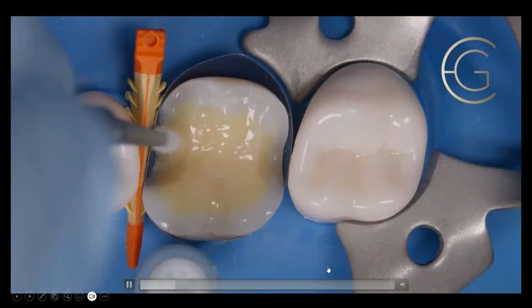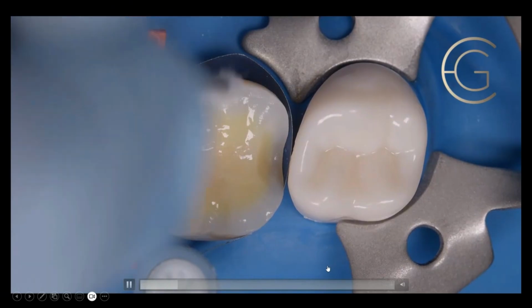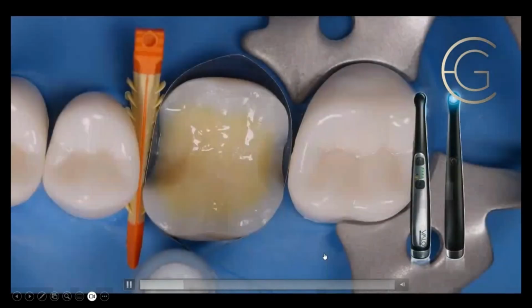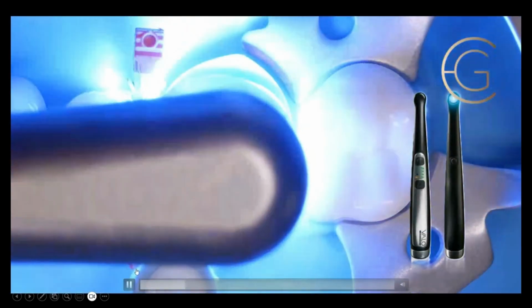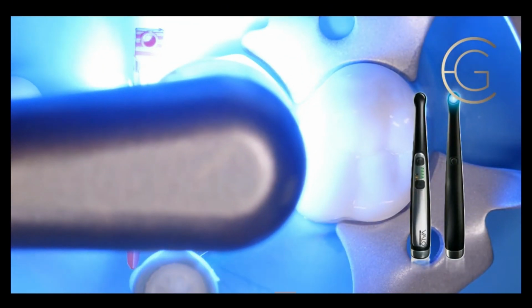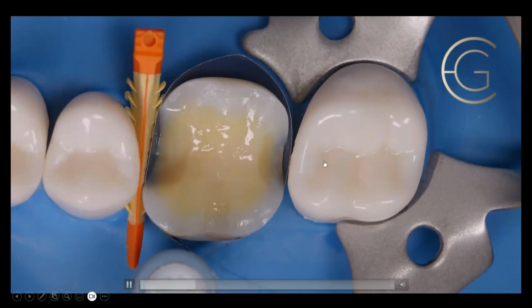So guess what? Now I'm going to take a brush and wick off the excess. You can't really see it there, but I wicked off the band because this bonds to the band. Even a Teflon coated band, it will bond to it because MDP bonds to just about anything. So now I'm going to light cure this, and I'm going to get a good 10-second cure. And guess what? We've now just finished immediate dentin sealing on this preparation.